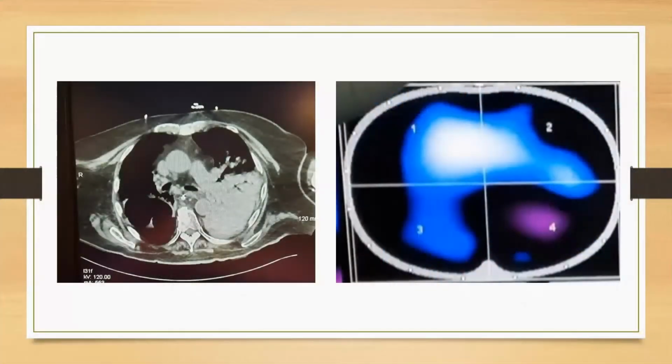Here again, we see the distribution of ventilation compared to a CT scan, very accurate. There's a pleural effusion also in this area, and that shows up as a negative impedance, a purple area. So we can often catch pleural effusions, or if there's a significant amount of fluid, you can catch those very early. And it can help also the doctor to decide whether or not they want to tap that and remove it. Here you see that the distribution of ventilation is seriously affected in the left lower quadrant, the left dorsal and mid-dorsal region. Just going to play another video here.